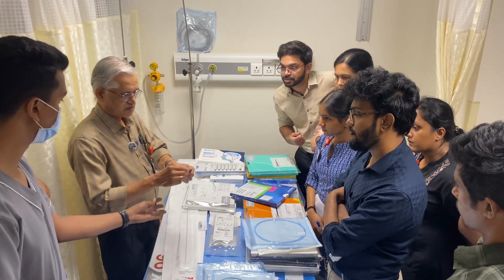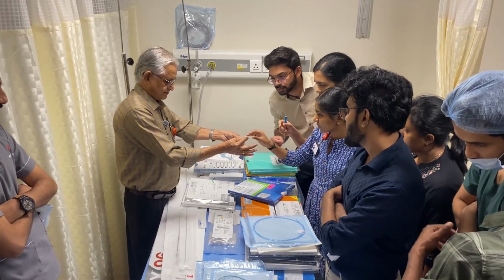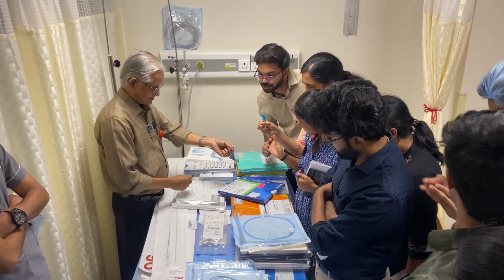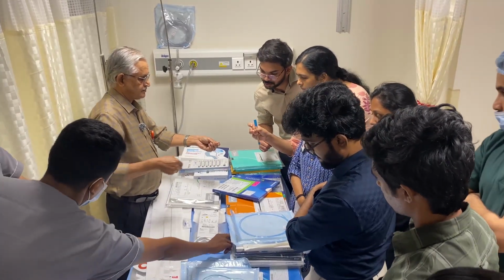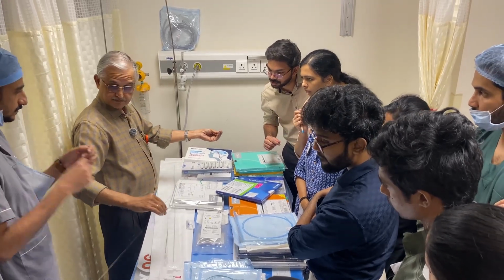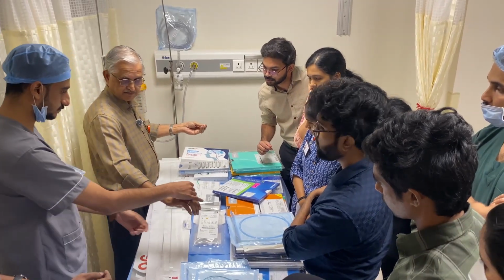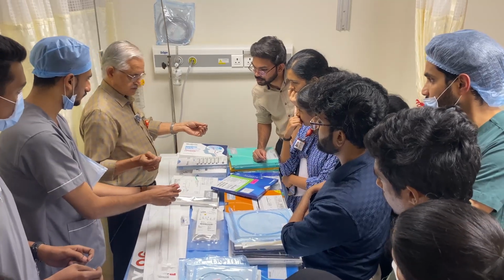So, okay, this is how it looks. This is the size of the microcatheter, you can feel, and this is the pusher wire. It pulls out easily. Now from there you can push and see. So once you pass this beyond the occlusion, now you open it up.